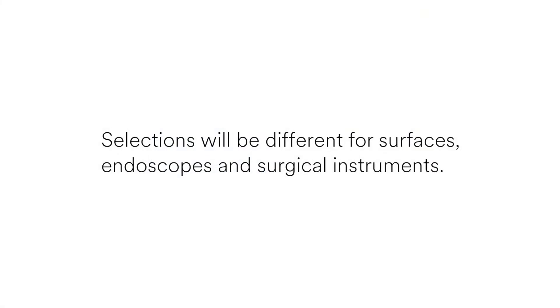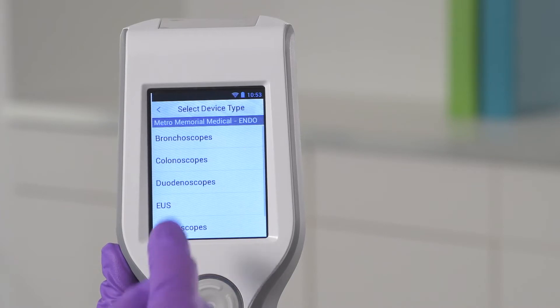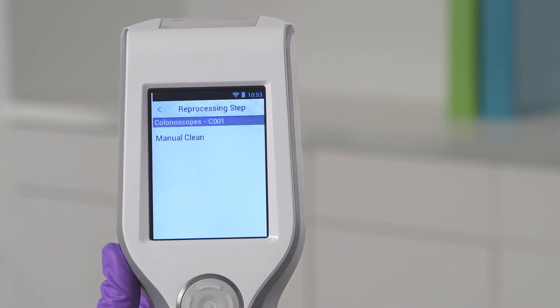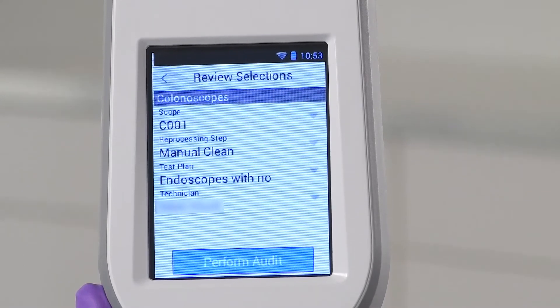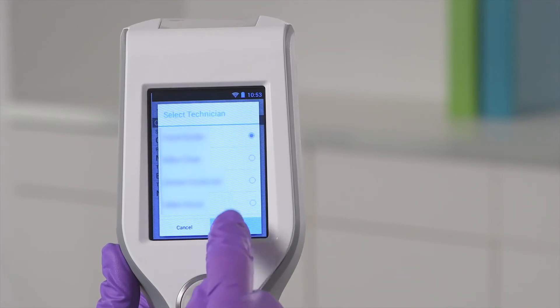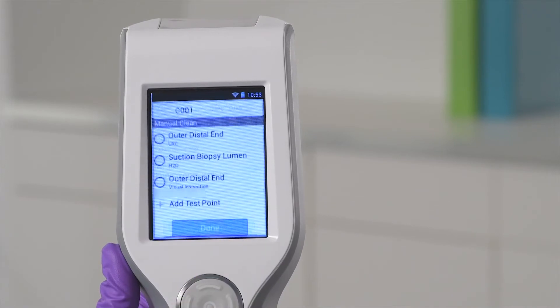Depending on if you are using the Clean Trace system to monitor surfaces, endoscopes, or surgical instruments, your selections will look a little different. For each screen, select the identifiers for your sample. For instance, with an endoscope, you will select the device type, the device — typically a serial number or other unique identifier — and then the reprocessing step. From the Review Selection screen, you can change the device, reprocessing step, test plan, or technician, or select the value for any user-defined fields that have been set up. When you are satisfied with your selections, tap Perform Audit.